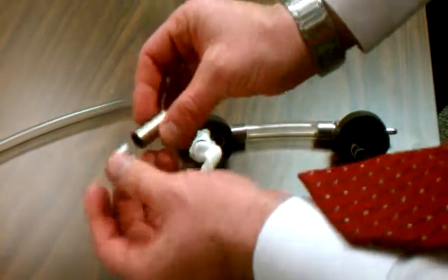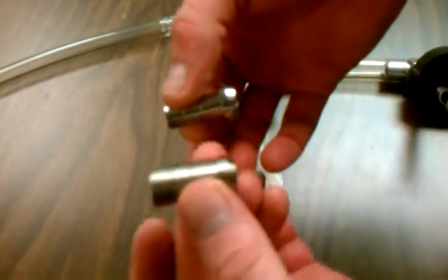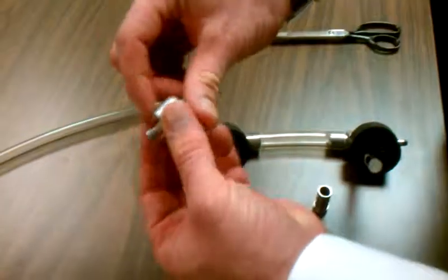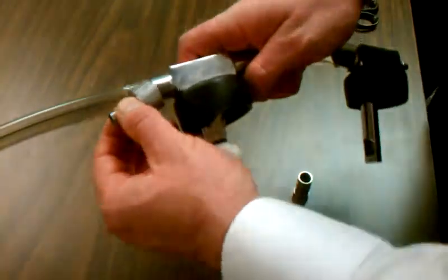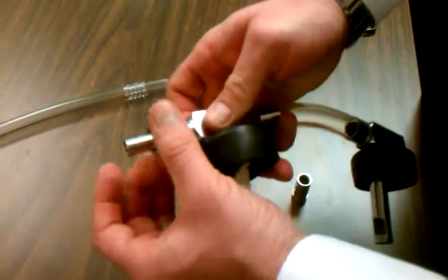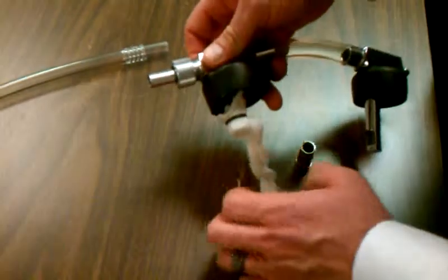In your package, in the kit, there are actually two nipple sizes. This is a half inch, and this is a three-eighths inch nipple. You insert the three-eighths inch nipple, then you're going to re-thread it back onto this fitting. So now it's ready to adapt the hose.